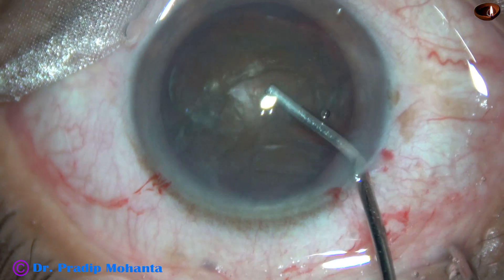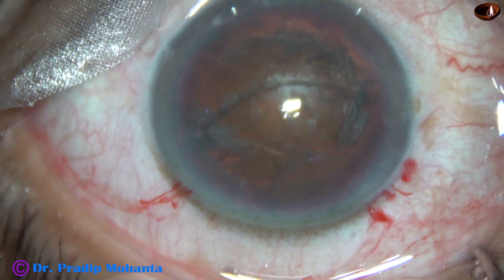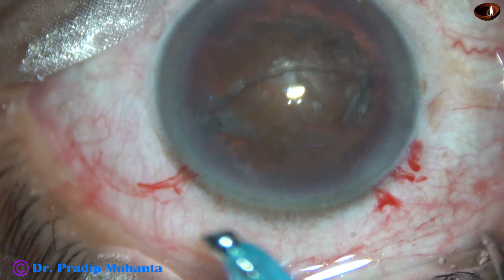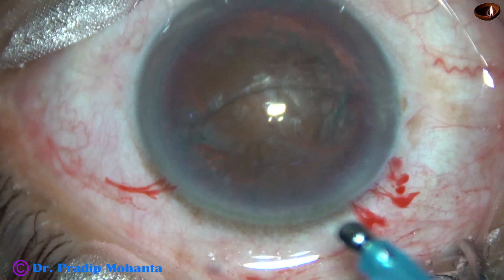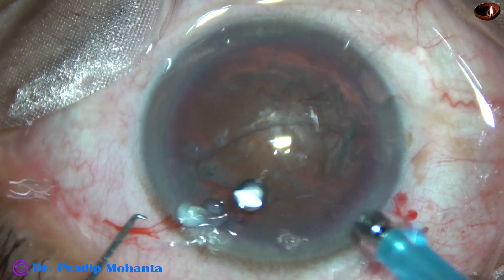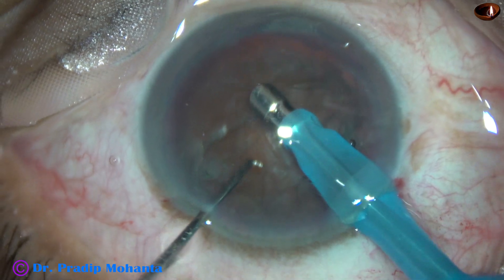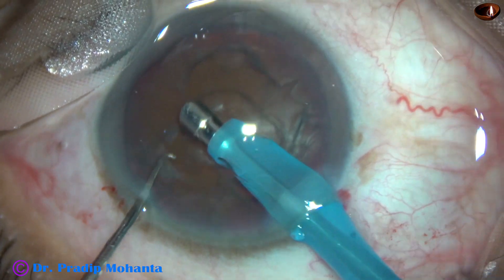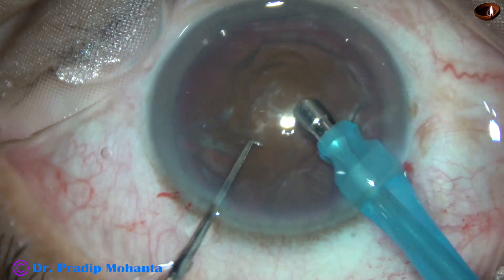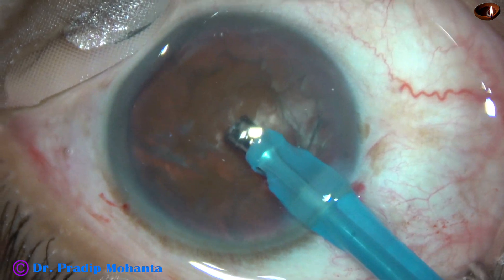Viscoelastic is again injected. Now is the time to introduce the tip of the phaco needle into the anterior chamber. This is the Oatley Cataract-3. The tip of the phaco needle goes into the anterior chamber with its bevel down. See the exposed part of the phaco needle — this much should be the exposed part in case of a hard cataract.